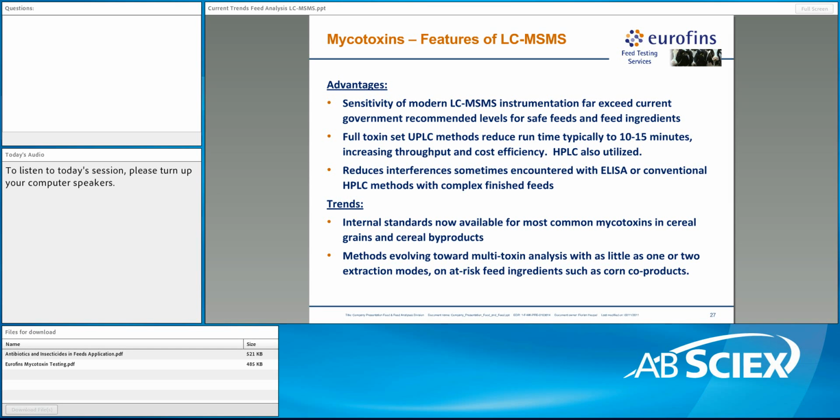Trends that we're currently observing is the use of internal standards, which are becoming more and more available for the various mycotoxin compounds. These are labeled internal standards, and the common mycotoxins, of course, are the ones that we typically see in cereal products and cereal grain byproducts now. We also see methods evolving more toward multitoxin analysis with as little as 1 or 2 extraction modes, and we'll be talking about those in just a minute.